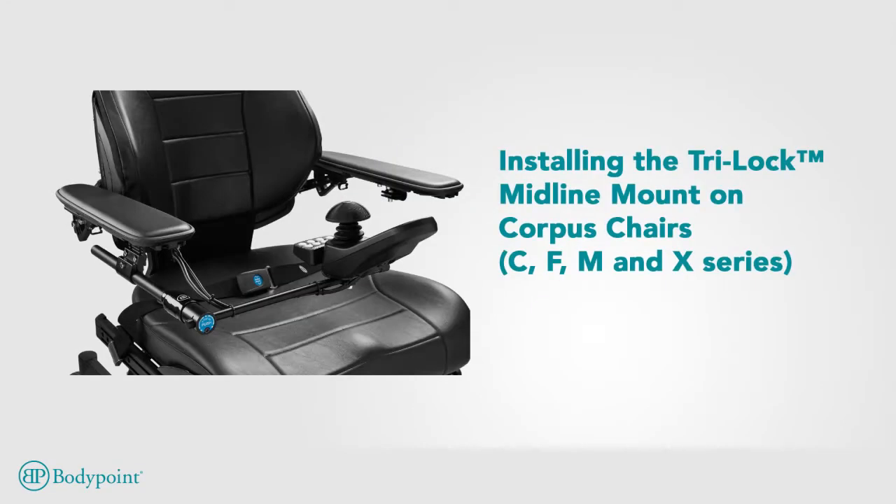The TriLock midline mounting system places driving controls just where the user needs them. Here's how to install the system on a Permobile.